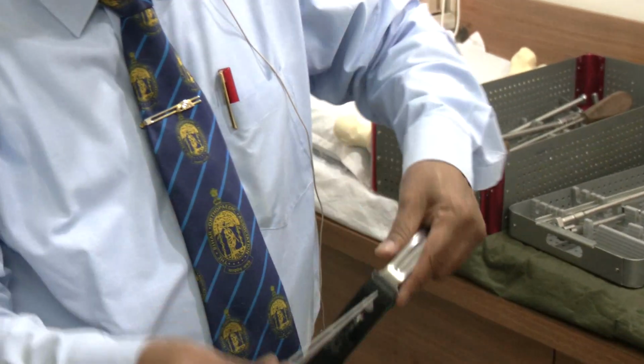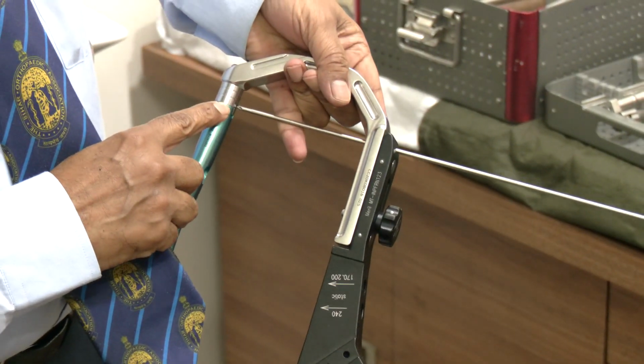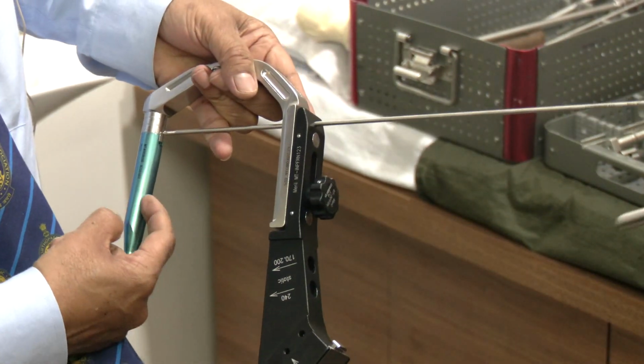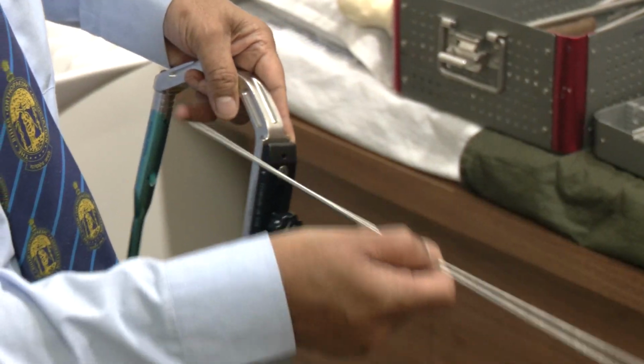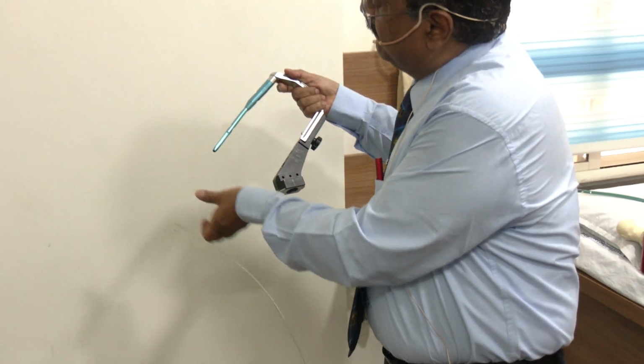So there is a hole here, so that will give an idea about where the nail tip is ending. This is not very important. What we are interested in is where the hole will end, but it will give an approximate idea about where the tip of the nail will be. So now I have assembled the nail over the jig. I will pass over the guide wire.